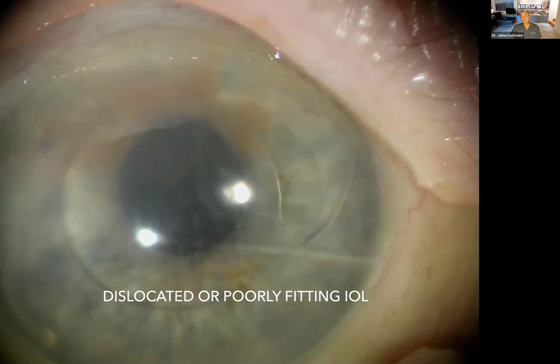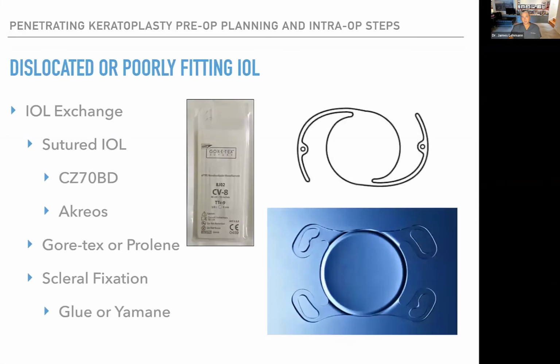I would remove that lens, and I would probably do a Yamane scleral fixated posterior chamber IOL, and then come back and try to do endothelial keratoplasty in this picture. So the point of this is it's better to do a staged technique. You have to do the IOL exchange first. You either suture the IOL with Gore-Tex or Prolene, or you do scleral fixation with glue or Yamane.